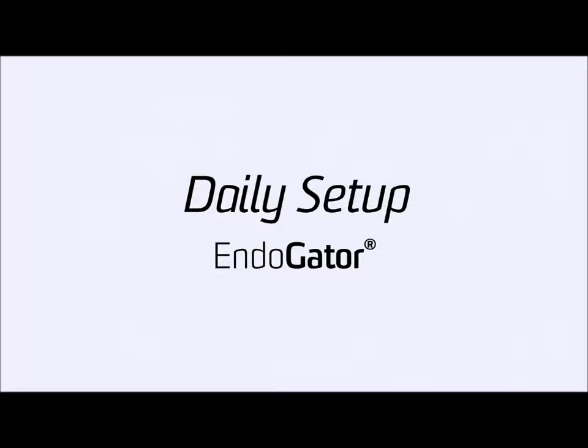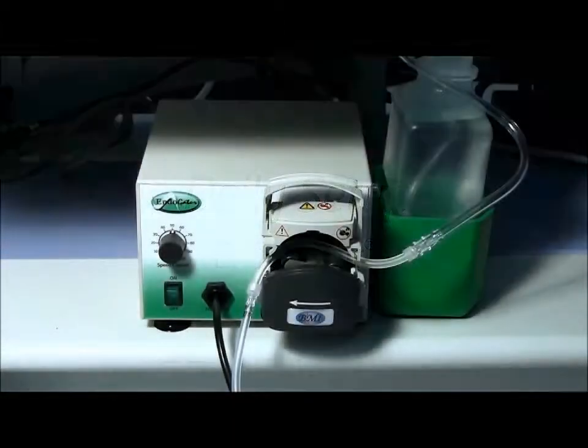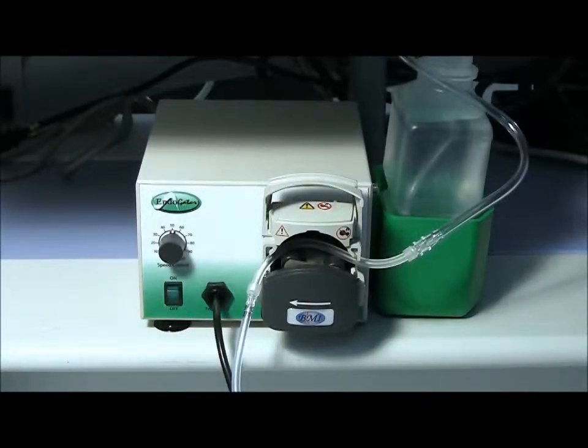It also has an endogator tube set specifically designed to be used with our EGP100 irrigator. With our pump, a water bottle holder is provided. Place a sterile water bottle in the holder and connect the cap to the bottle in the exact same manner.